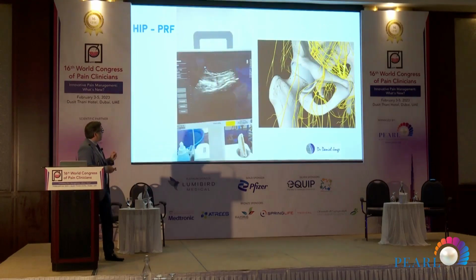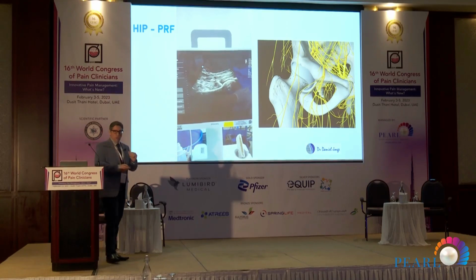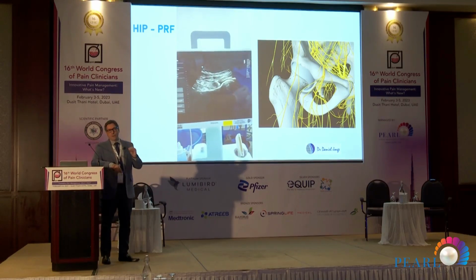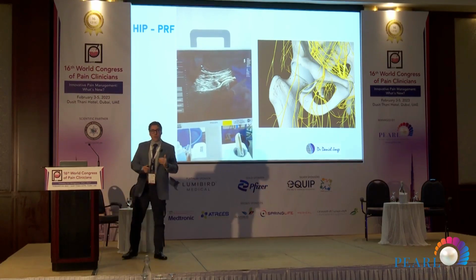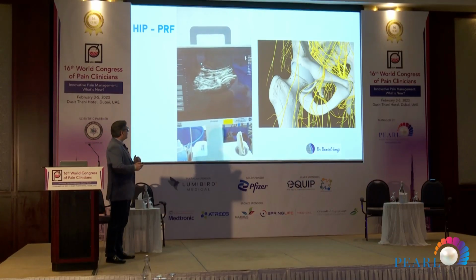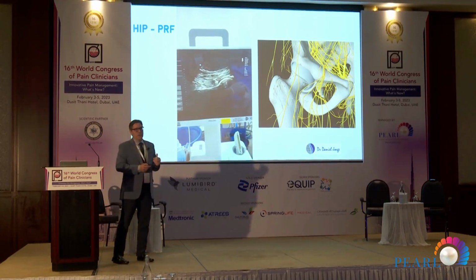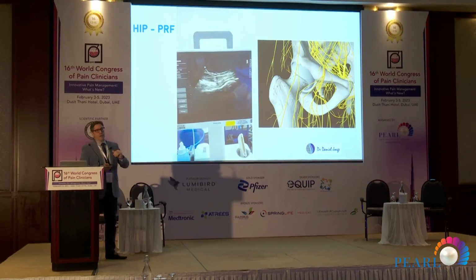For the obturator one, you may need the X-ray to go safer. But we are finding in our practice that maybe the obturator nerve is not quite necessary to go. It's a little bit difficult to go there, and maybe it's not so necessary, because a huge part of the femoral head is innervated by those femoral sensitive nerves. And then usually the patient had a good result using just the femoral branch and the interarticular approach as well.